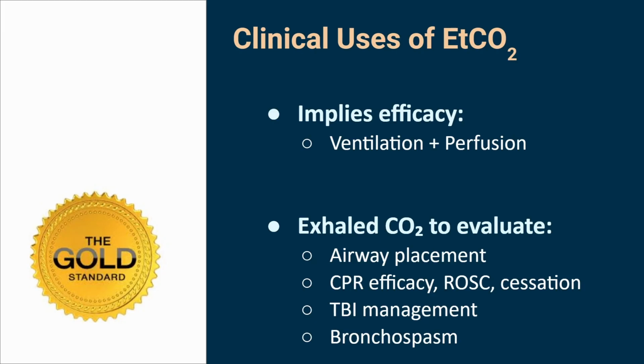In any event, clinical uses of EtCO2: it implies efficacy of ventilation and perfusion. This is probably the last place you will hear it this way. What you will hear everywhere is EtCO2 equals perfusion, and that's not quite right.